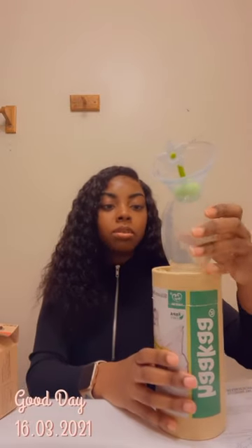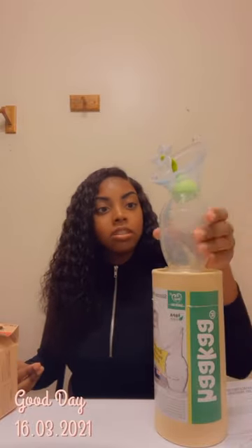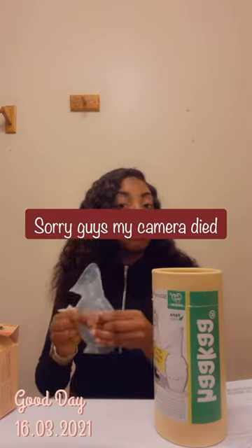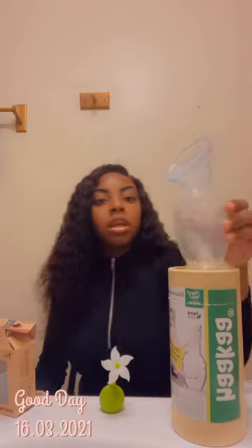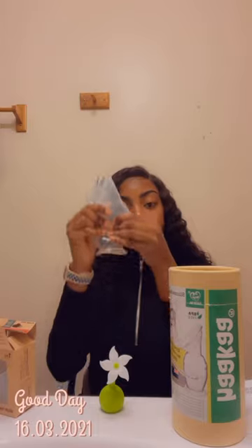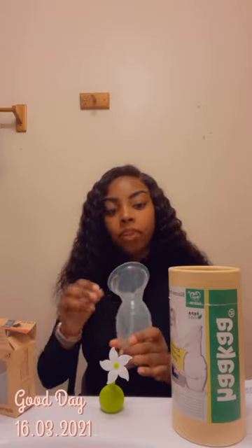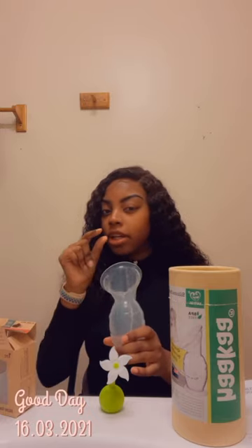At first when I tried to use the Haakaa I was a bit confused — it wasn't really working out for me. I was squeezing and nothing was coming out; it would just get stuck on my breast with no milk coming out because I didn't realize you actually have to squeeze the bottom of it a little bit and let some air in just a little bit.